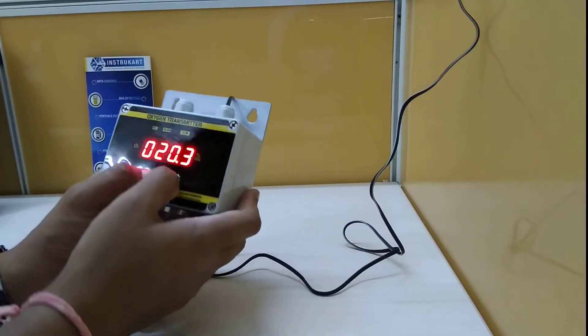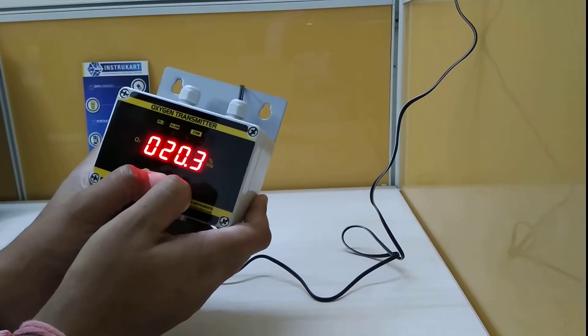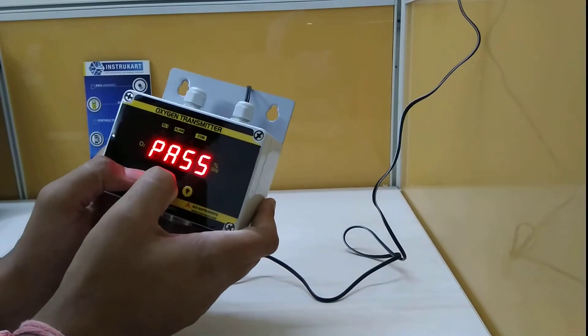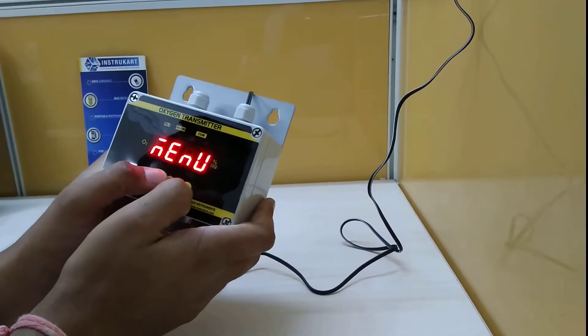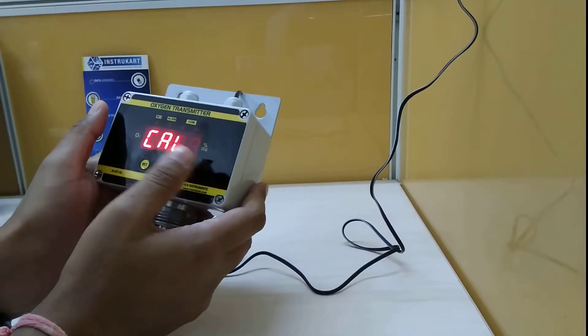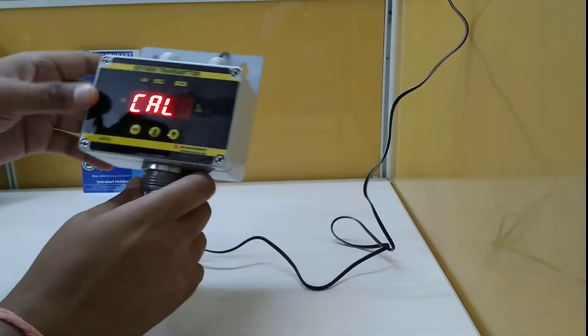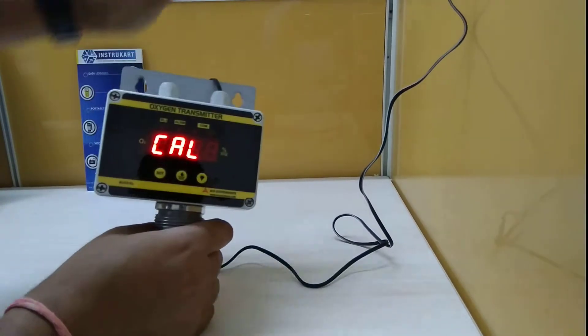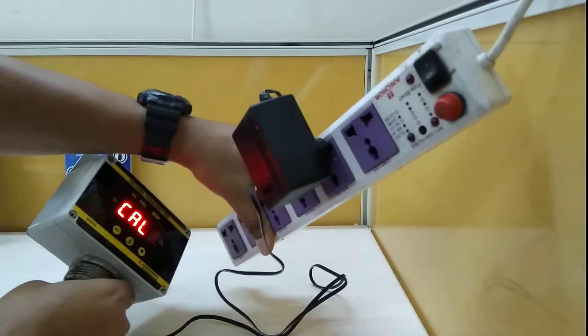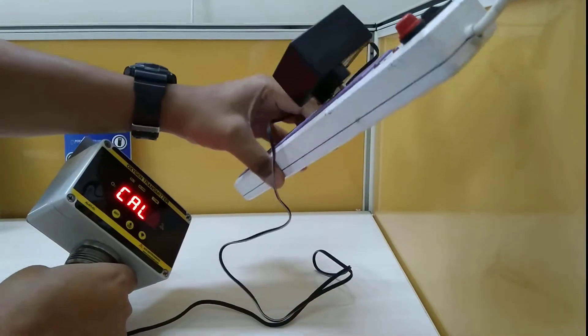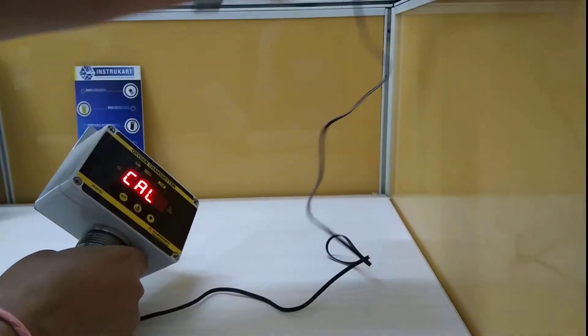To use the menu function, press and hold these two keys, enter the correct password, and then you can access the menu to set low and high setpoints. The oxygen transmitter runs on an adapter which is 24 volts DC and plugs into any 230-volt supply.